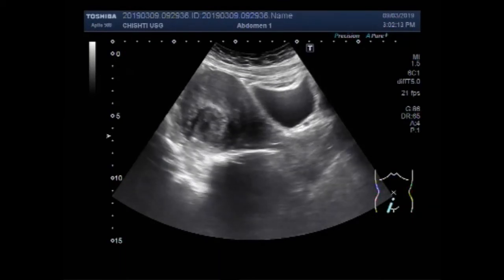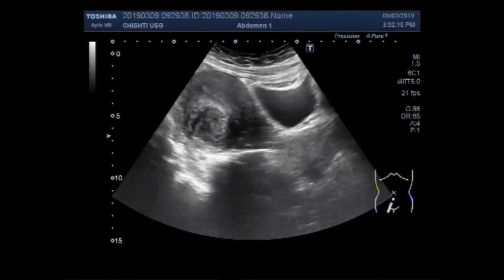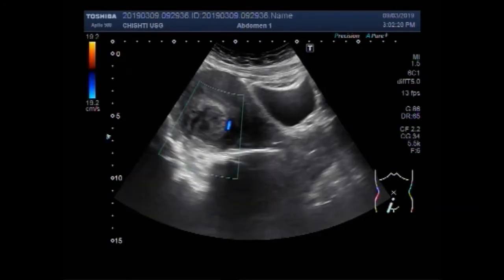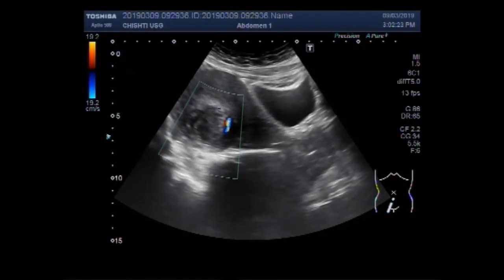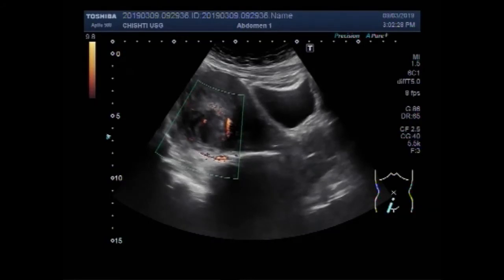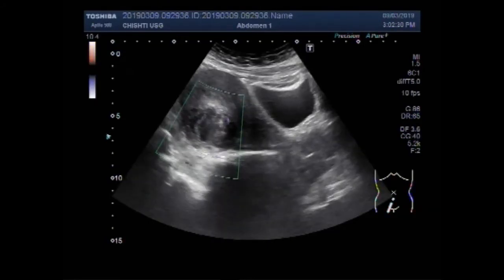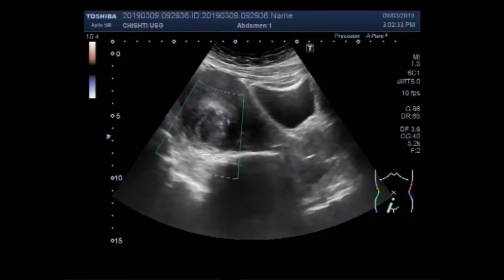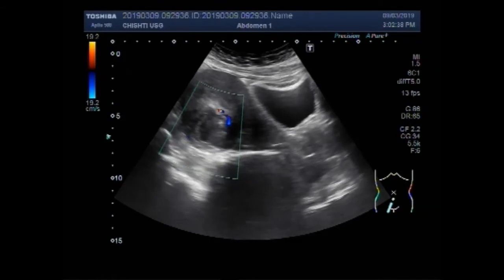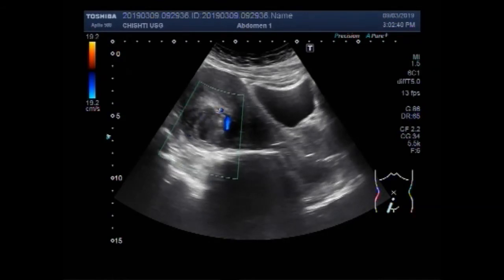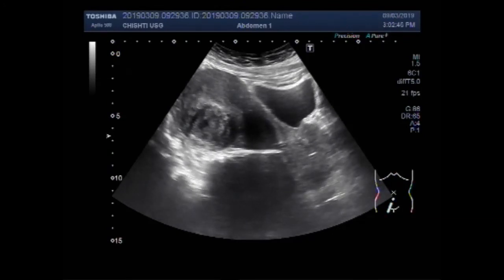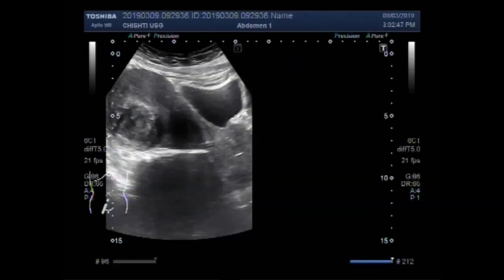A semi-solid to solid mass with heterogeneous echogenicity. Blood flow is also seen, especially in the rim region of the mass. You can see the round to oval shaped mass.